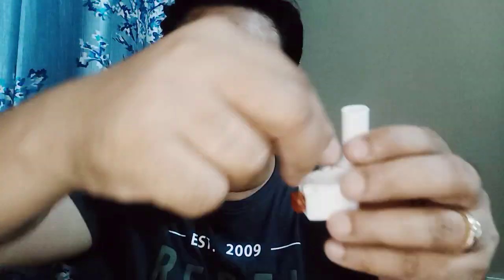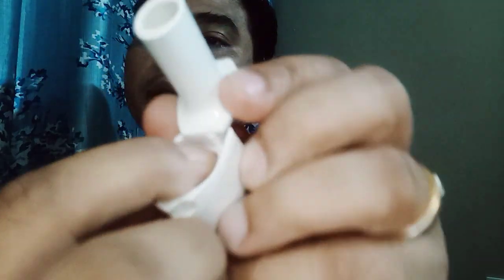Now we have opened this device. This capsule has medication, and I put it in here. You should see that this goes into this. Once it goes in, you close this back to position.